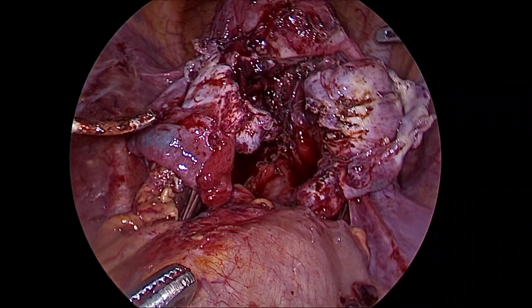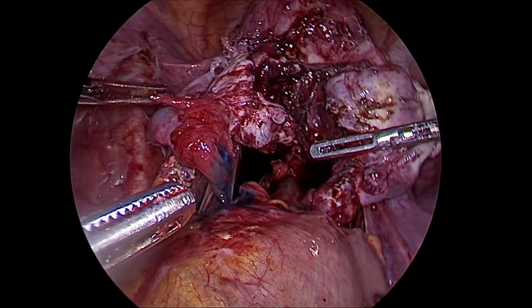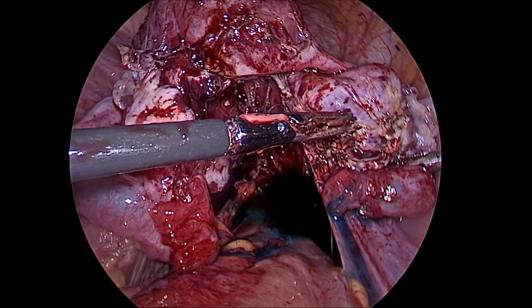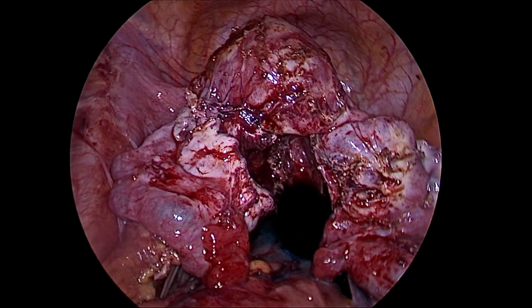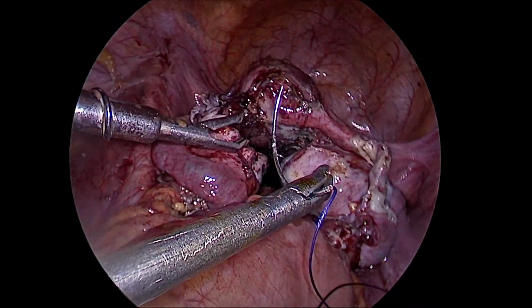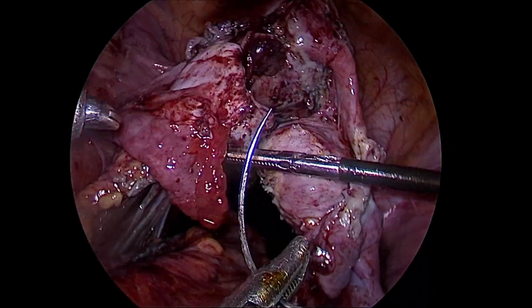As you can see now, the tube and the ovary is normal. The dye has been inserted through the vagina, and there is a free spill of dye on one side and again on the second side. So it was so surprising and so satisfying that after such a well done surgery, we have nice patent tubes in this particular woman.